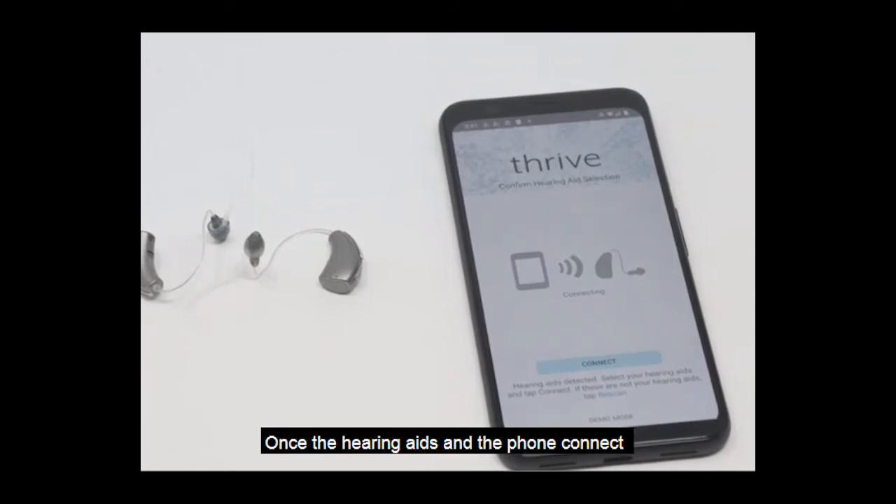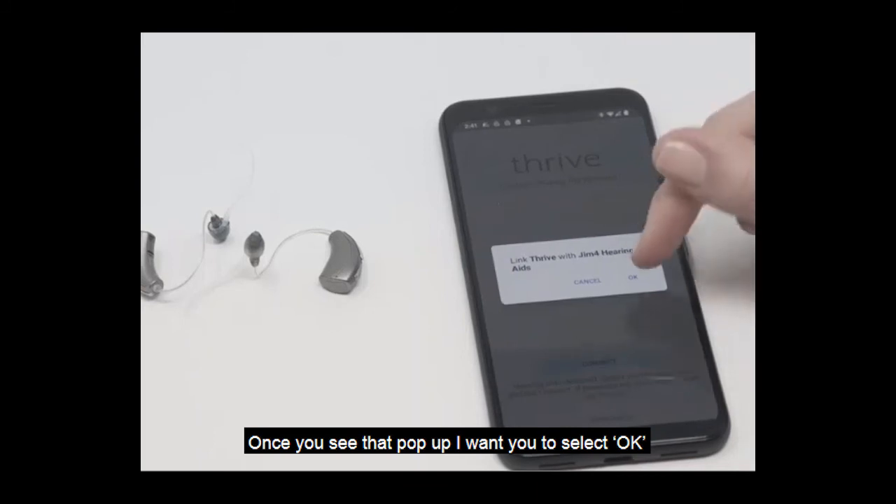Once the hearing aids and the phone connect, you'll get a pop-up asking for you to link the two. Once you see that pop-up, select OK.